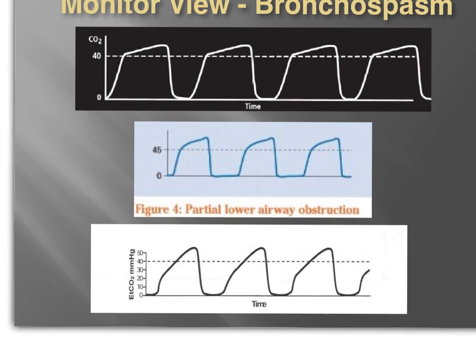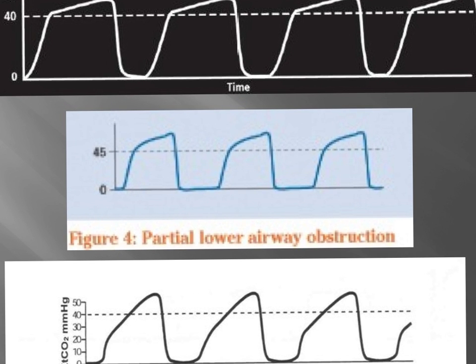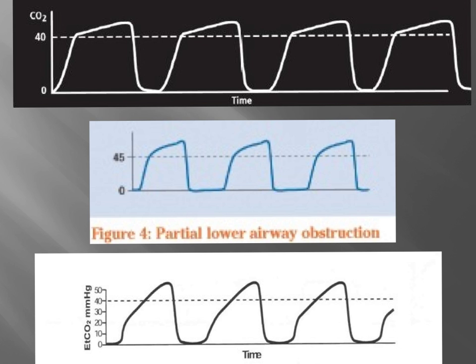So let's look at the waveform above here, though. Now let's look at this waveform and reduce that a little bit so it looks a little bit better. This one we can see most likely would be a screenshot of the monitor as well. It's condensed in time, so it's a little bit easier to read, even though it's not truly diagnostic, like we said with the printout.